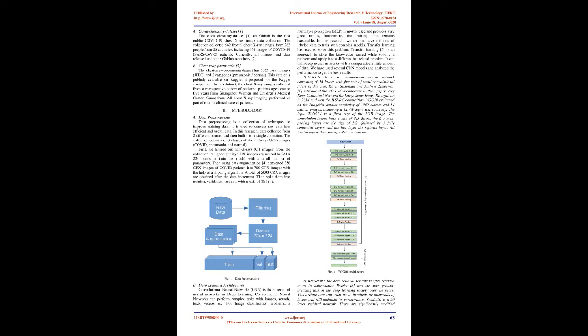In this research paper, due to the unavailability of chest X-ray images of COVID-19 patients, we used data augmentation to increase the amount of image data. The role of data augmentation is to help train the model and achieve better accuracy. The chest X-ray images are used in the diagnosis of disease in the healthcare system. For the classification of chest X-ray images, we obtained better results using VGG16, DenseNet 121, ResNet 50, Inception V3, and the Xception model.